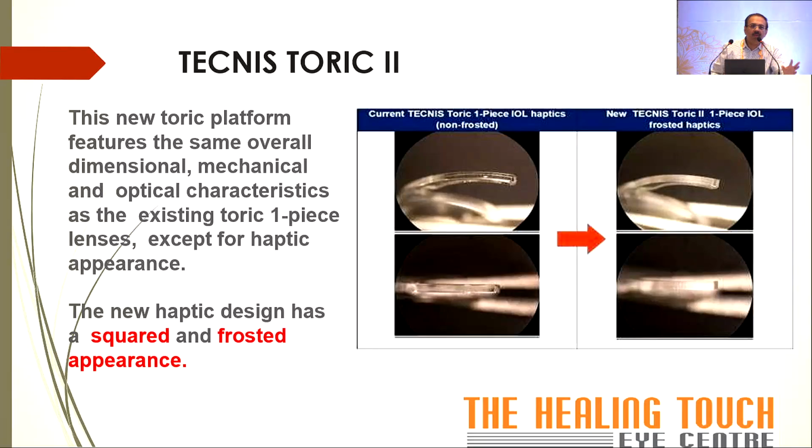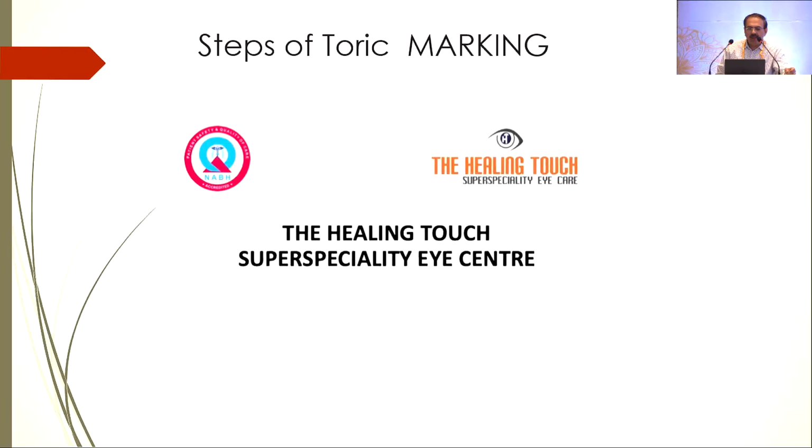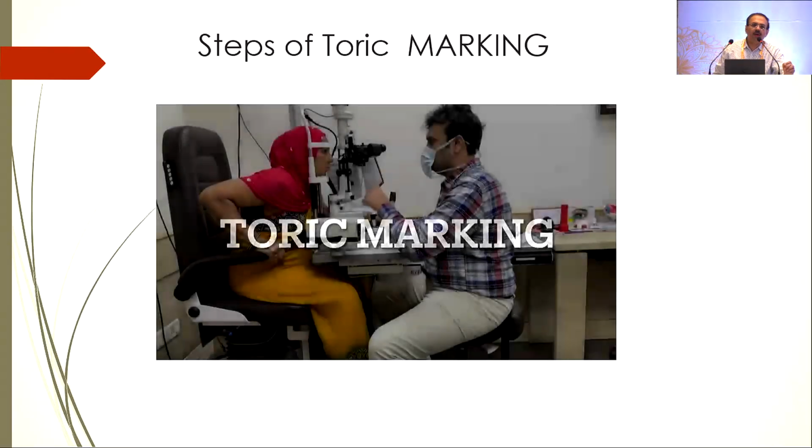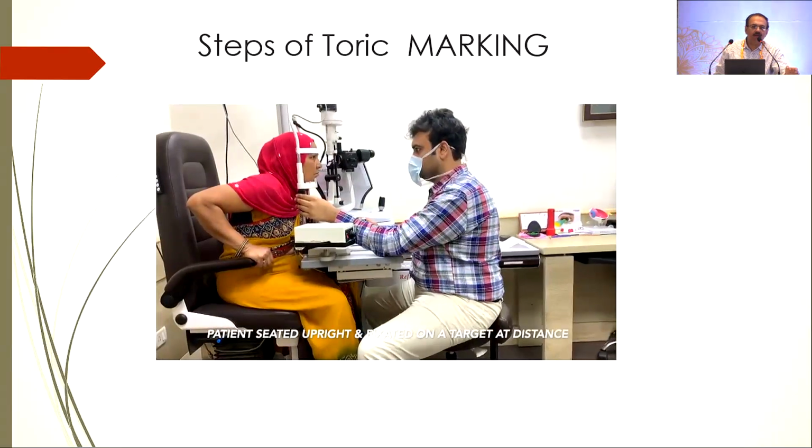So the IOL design is very important, and it is not only the surgeon's placement which decides the lens stability. Here is just a small video to show how to plan a toric lens.